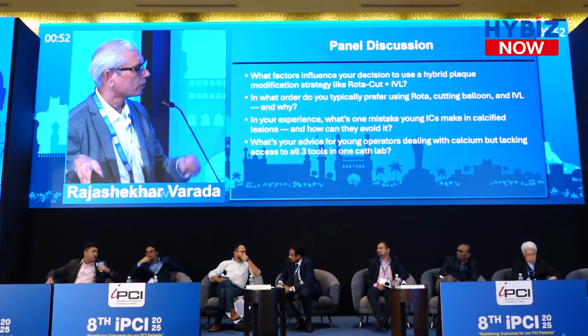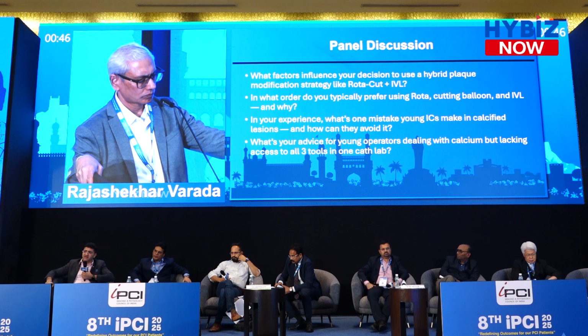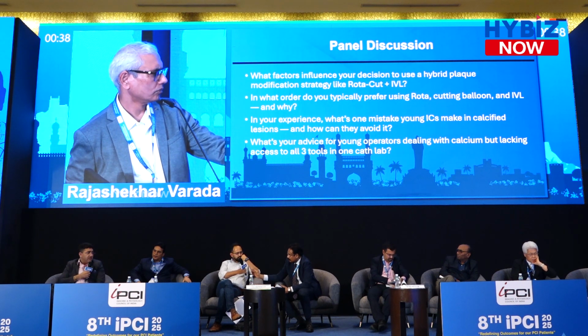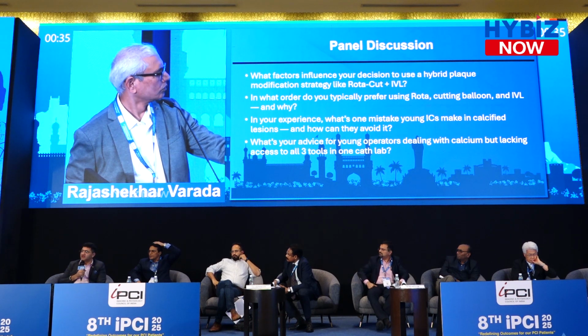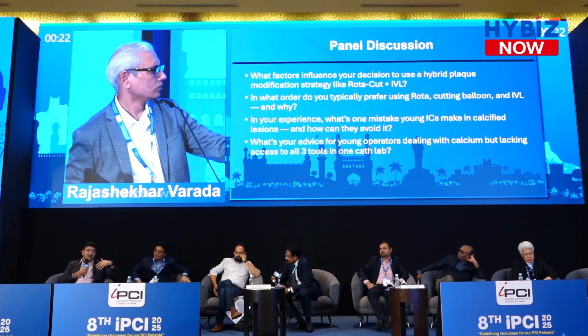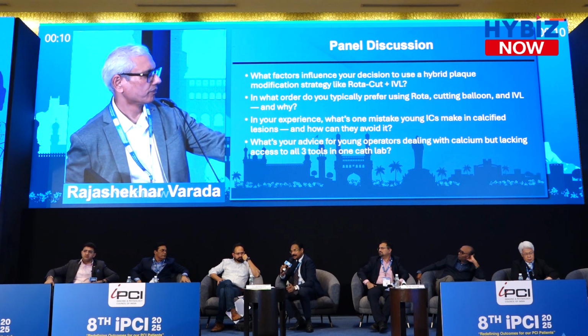One should always give time for such a long stent to get deflated before pulling it, because that is a precursor of longitudinal stent deformation. And you won't see it on the angio, and you may miss it on the IVUS if you are not looking for it. So in our lab, the final thing that we do when we are coming out is POT, because we have learned from the OCTOBER study about USD, unintended stent deformation, out of the left main. Last thing, do POT and come out. Because your guide will hit the proximal edge of the stent, always slide the guide over the balloon when we deflate and take the balloon out. That's the best strategy.